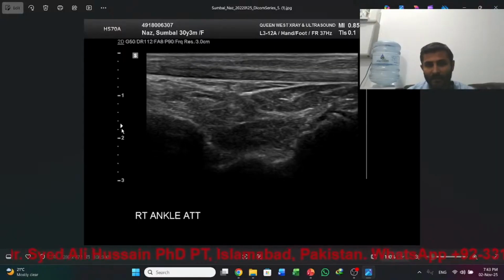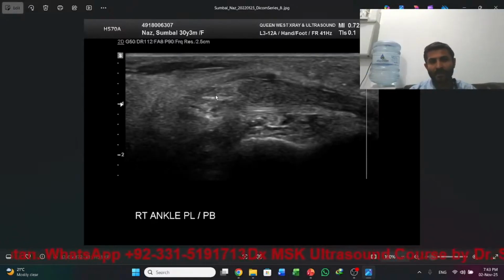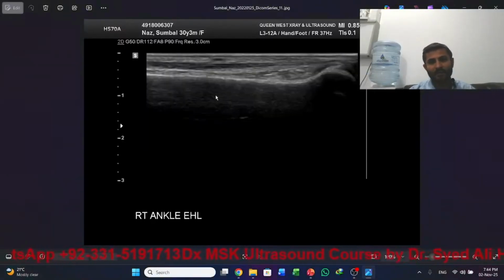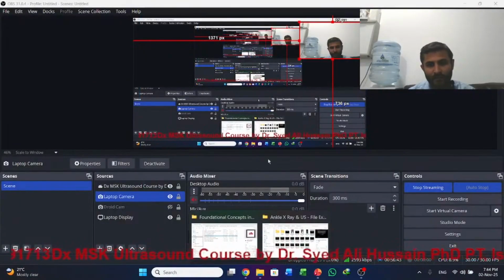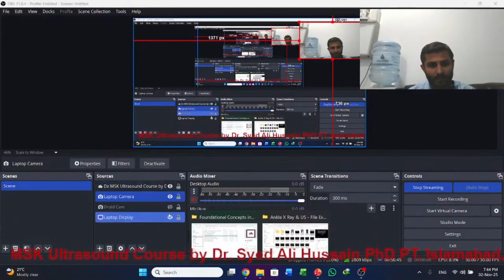And this is telling you the marker of focus. So this is the point of focus for this. It should be, if it were over here, this image could have been even better. So similarly, there are different ultrasound images, and I can also try to show you some other images as well.